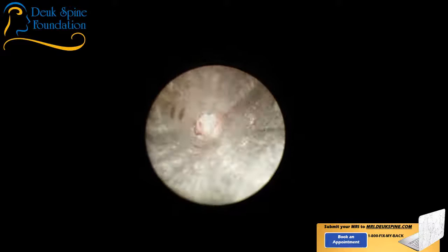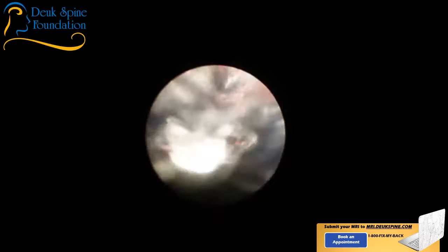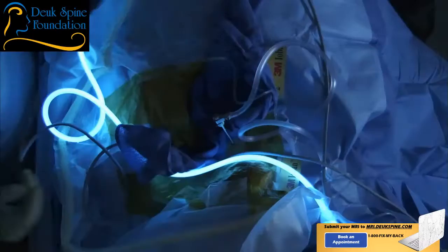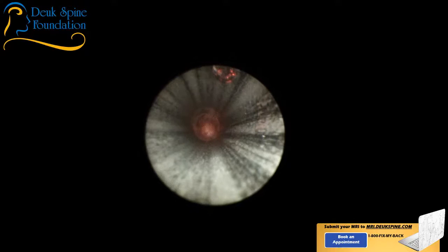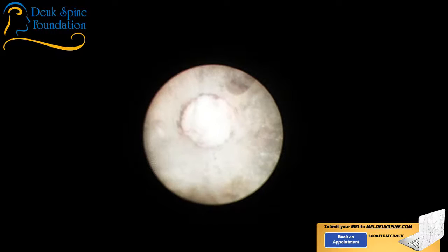We're going to switch the view so you all can see through the endoscope — that's the metal tube I'm working through, and that's the base of the disc herniation right there. I'm going to take my endoscope out and try to grab a piece of that herniation and bring it out. I like to send this stuff to the pathologist to make sure there's nothing like an infection or cancer, and that it's just a herniated disc. You can see the laser fiber there — it's almost at 12 o'clock.